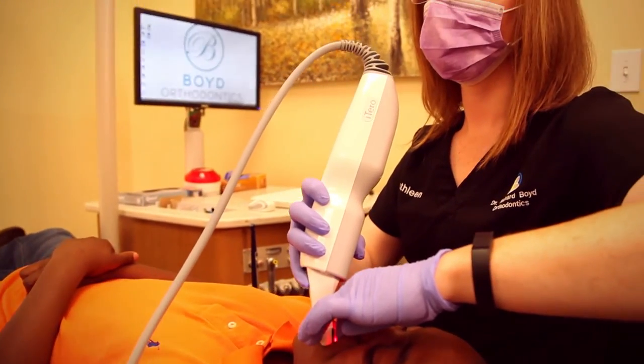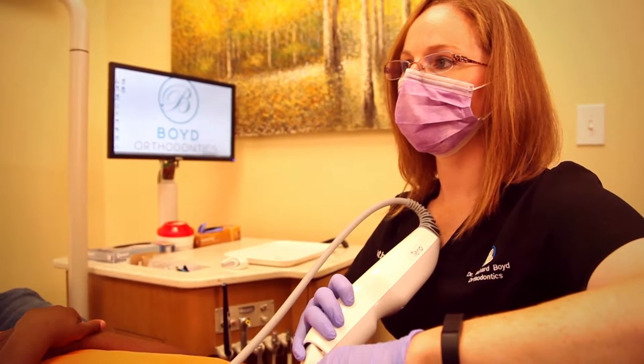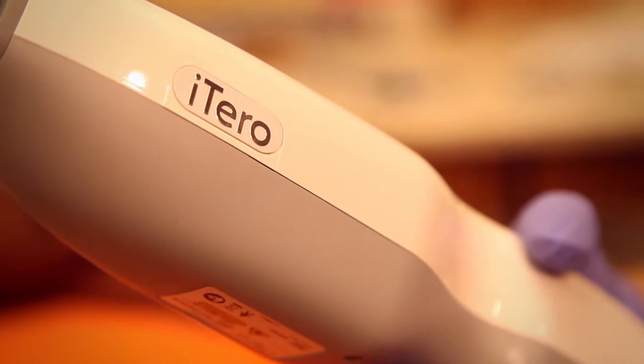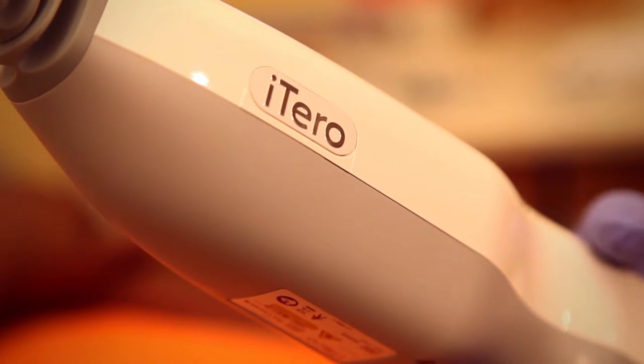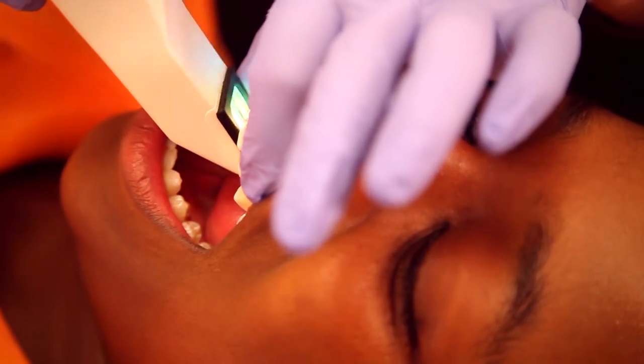The digital scanner is a wand, and you basically do a 3D scan of the inside of somebody's mouth. It eliminates the need for the impression and cuts down on manufacturing time, so we can usually get the trays back faster, which gets people started with their treatment sooner.